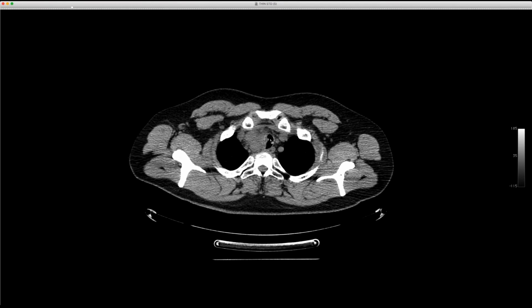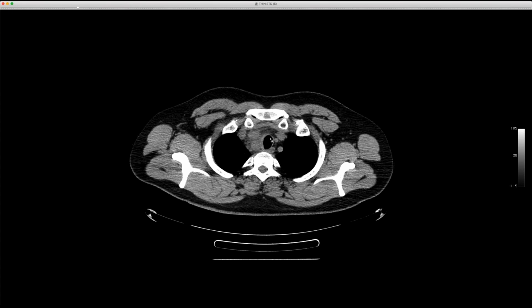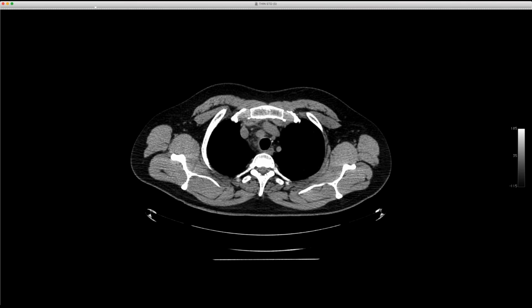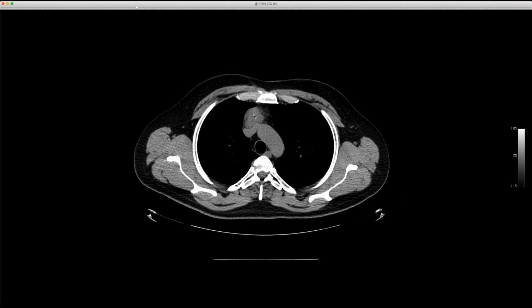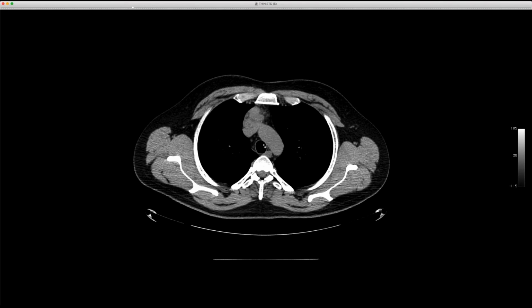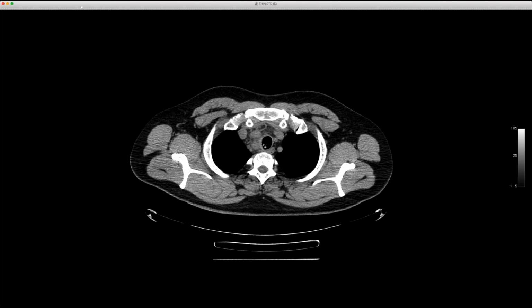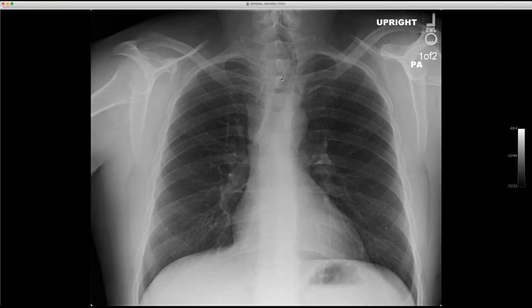So presumably a neck node that extended directly in. Young patients, as you said, Howard, adenoid cystics, they tend to be localized early on. But I have seen a couple cases of lymphoma involving the trachea. It's probably through direct extension. This lesion here looks like it's arising in the thymic area, which would make you think of either metastases or lymphoma. But another young patient with an abnormal airway mass. I'll show you the radiograph. Oh, looks like a thyroid goiter on the radiograph. Yeah.